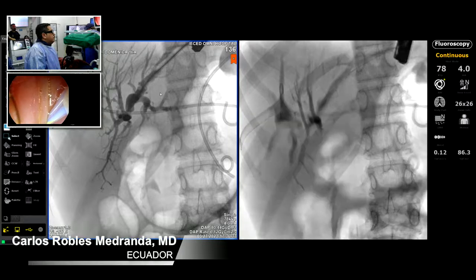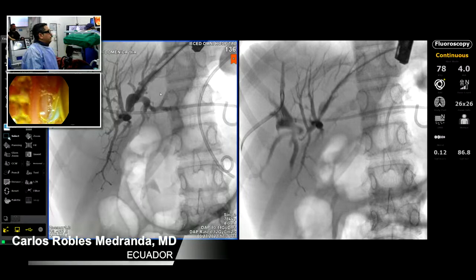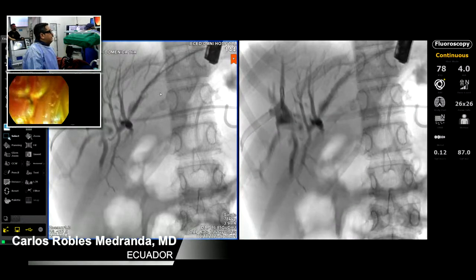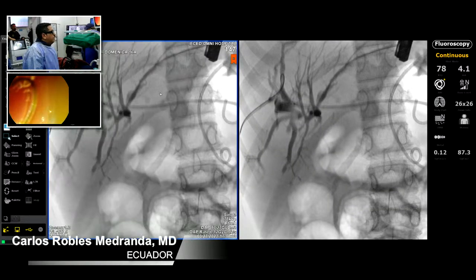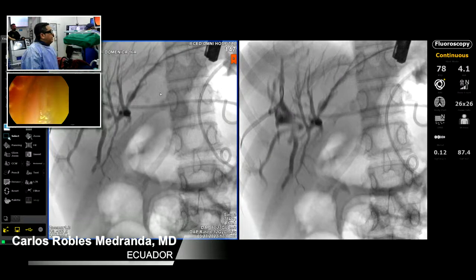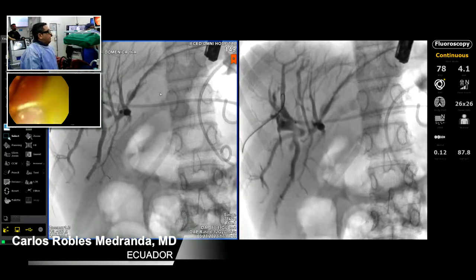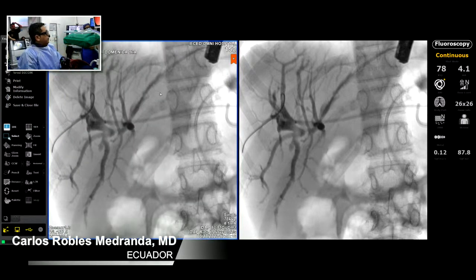The divorce is there. Let me see if I have the divorce there. You see? So now I have a communication. So I create a fistula also between the right and left. And that is very good.